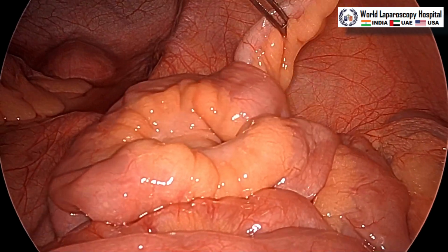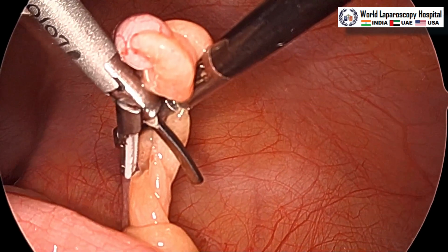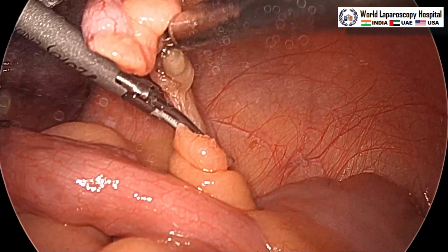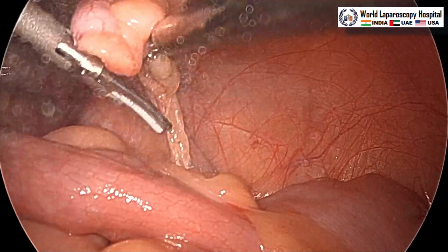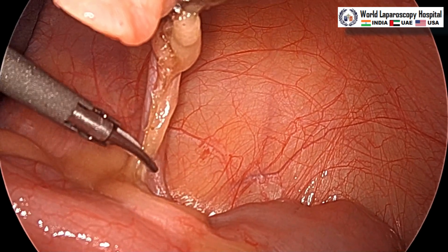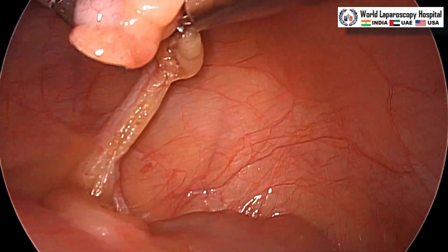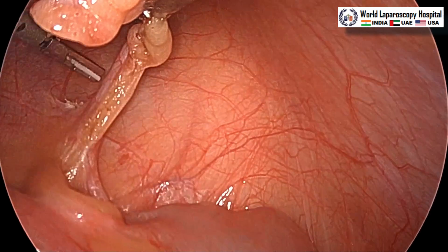Here we are holding the appendix, and this is held by the right hypochondrium port, and with the umbilical port we are using the harmonic to separate the mesoappendix. So, you do not need any extra port. The surgeon has to move near the shoulder, and this is slowly separating the mesoappendix from the appendix. At that time, anteromedial traction will be given by the assistant, and you can separate laterally. Sometimes a little lateral mobilization is also required. So, at that time you have to give anteromedial traction over the appendix, and then you can open the peritoneal fold so that you can reach up to the base of the appendix.